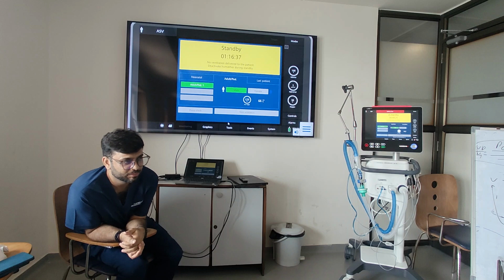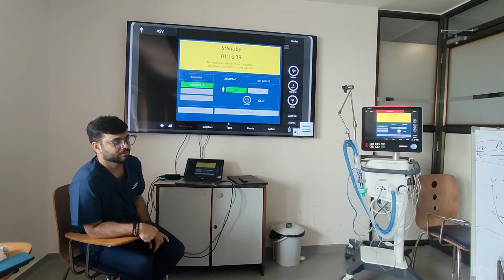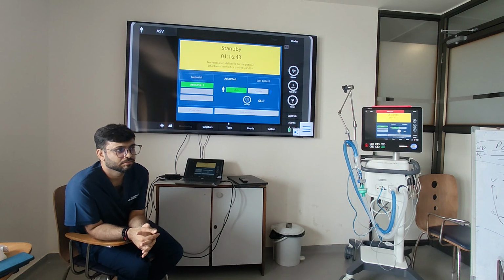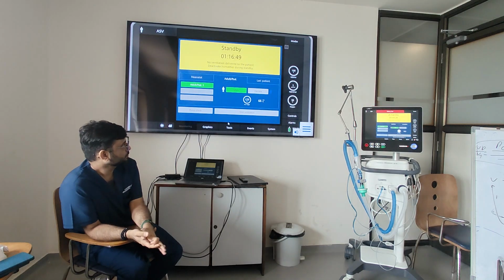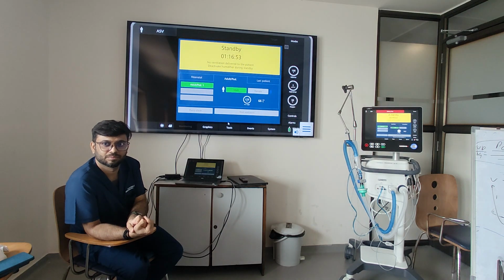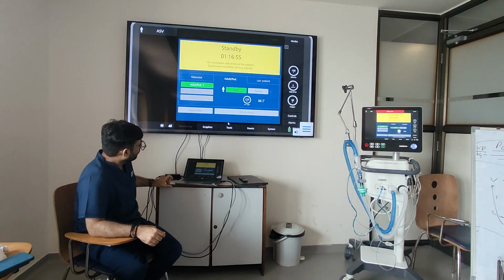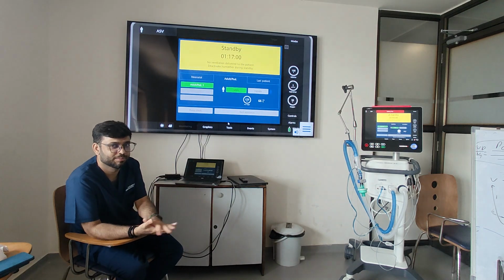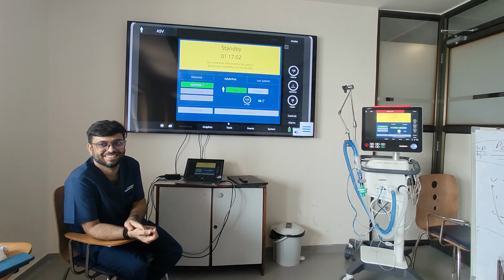Okay, so your patient will basically come in as a stroke patient whose GCS is 8/15. You decided to intubate him because you wanted airway protection. Now you intubate. You will set the ventilator. So first we'll go to the pre-op check. All that is done. Pre-op check is done. Okay, height.